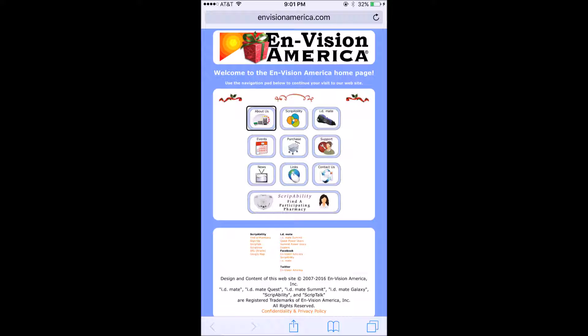So I'm going to show you the ScriptTalk unit. What I have in my hand is a unit that is probably about five inches by seven inches wide, about five inches in the other dimension, and about an inch thick. Across the top it's got a tactile area where you can actually put the bottle on, and then it's got three buttons across the bottom. I'm going to show you how the unit works — I'm going to turn it on.